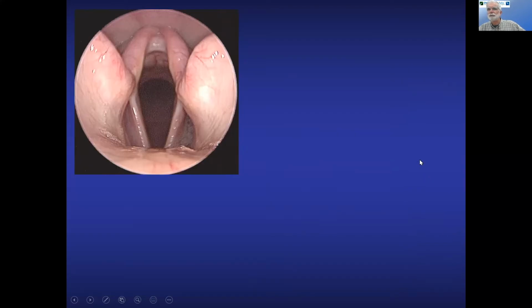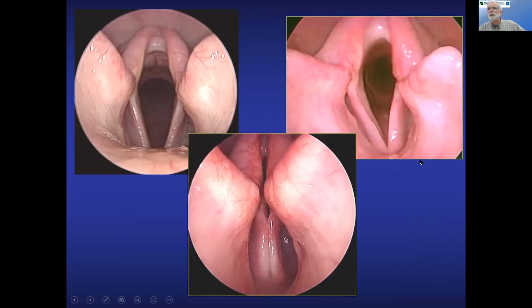Okay, so looking at those, you can see that and the difference down the middle here. So these normal, obviously no problem here. This guy can barely breathe on inspiration. He's squeaking, doing that. And there's a subtle difference here. Maybe you'd call this side weak. Maybe if we looked at it a little different later, he turned into this, we don't know.